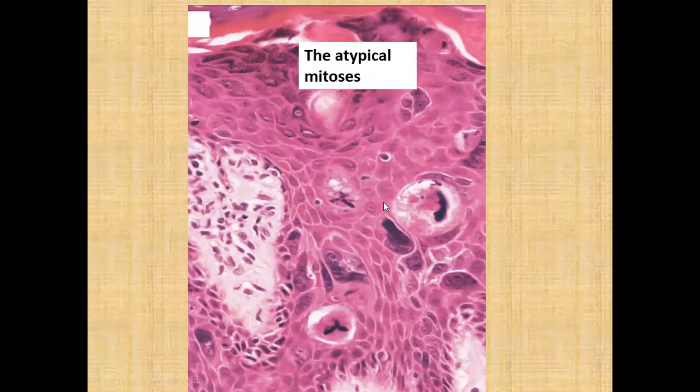So these are several atypical cells. This is a big mitosis, and this is a cell with a large atypical nucleus. But you can see that even in the presence of such a marked degree of atypia, this cell is maintaining the desmosomal connection with the surrounding keratinocytes.